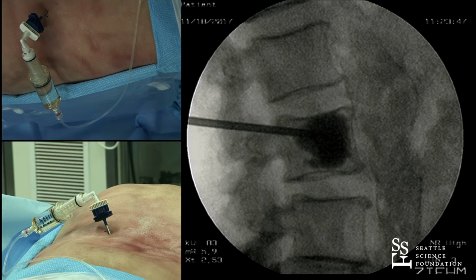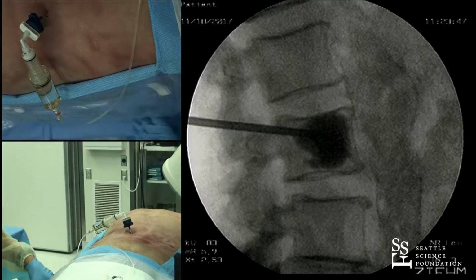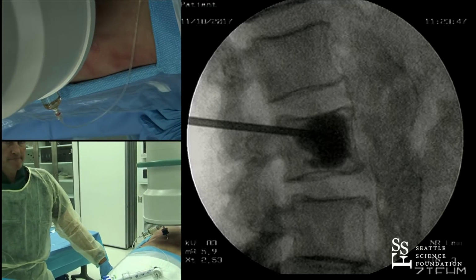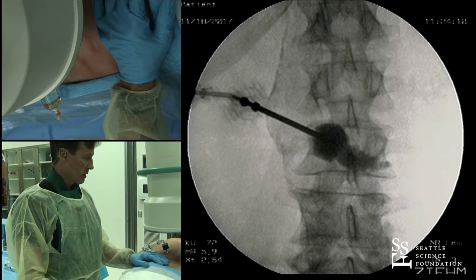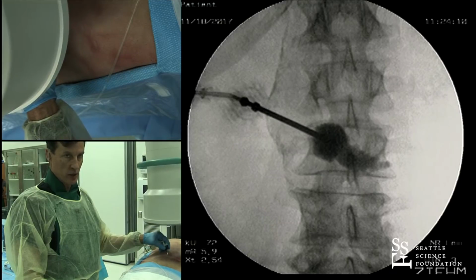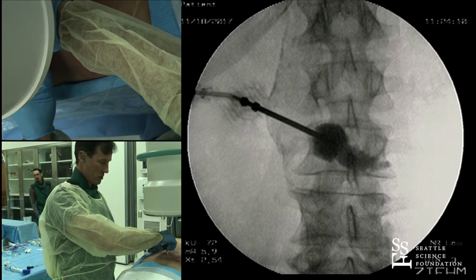We have a nice fill here, and that's right in the center of the vertebral body, end plate to end plate, and that meets our goal. So we'll save that one, and we will take another shot AP. And Doug, on the AP, is your goal to get support under both pedicles? If we're dissatisfied with this, probably, given the time, I would go back and access that other side and put more cement just to make it symmetric.